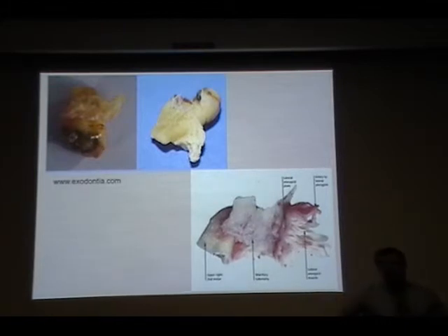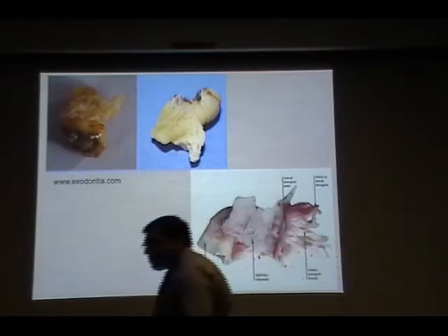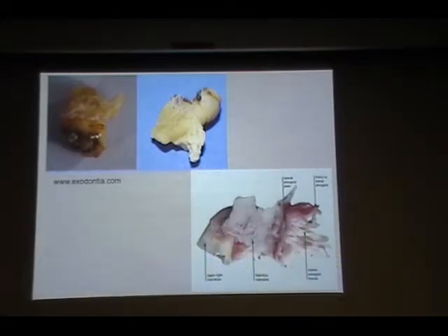That is unusual, at least I have not seen that fracture in my own personal experience. But in this example, yes, there is a fracture of the lateral pterygoid plate. So things could happen, so be careful. And if you're not confident, don't extract third molars. Stick to the teeth that you're more comfortable with.